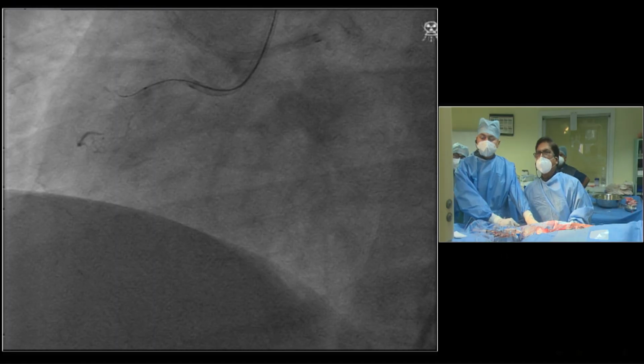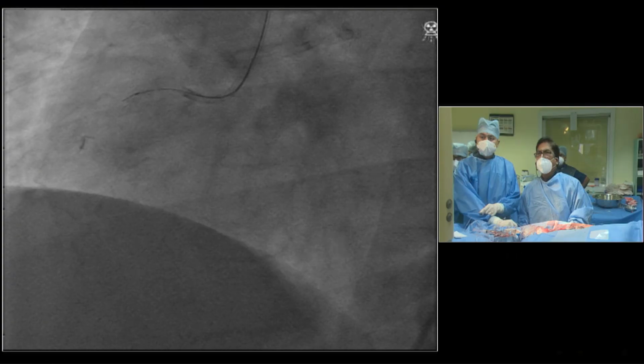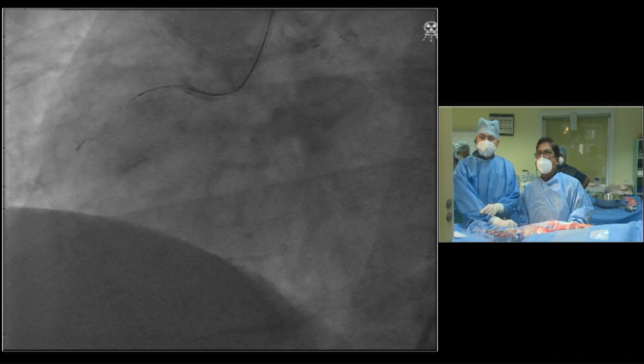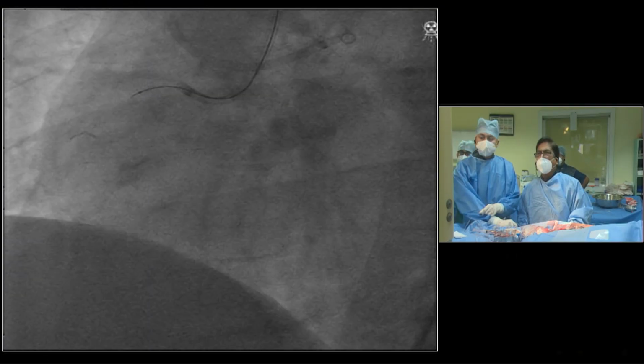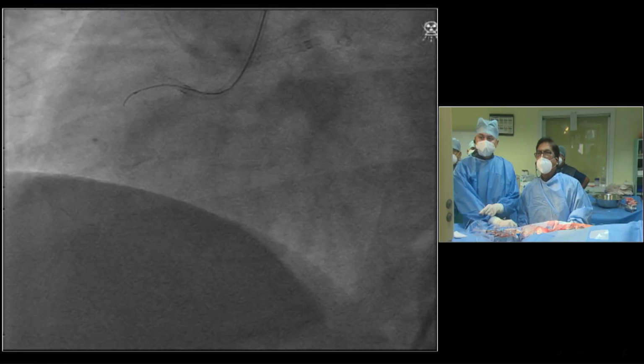I feel that is a long chronic segment and there is no kind of dimple there, no visible or perceptible channel. So what is your idea, Dr. Pratap? What is your first choice of wire in this case?